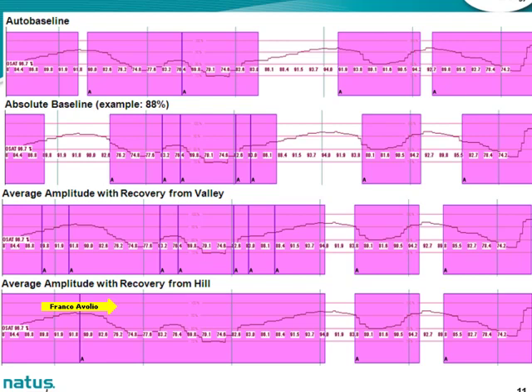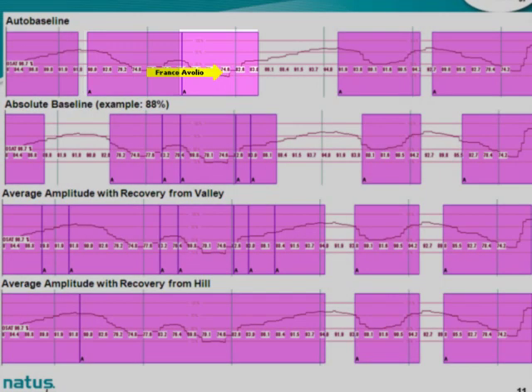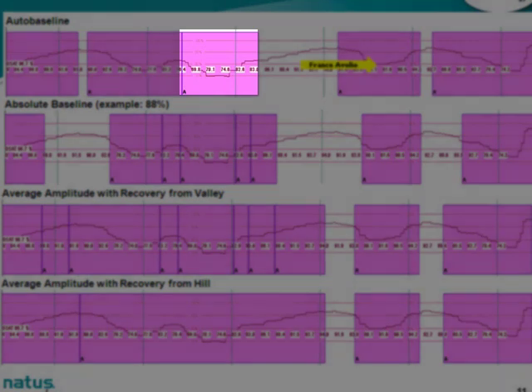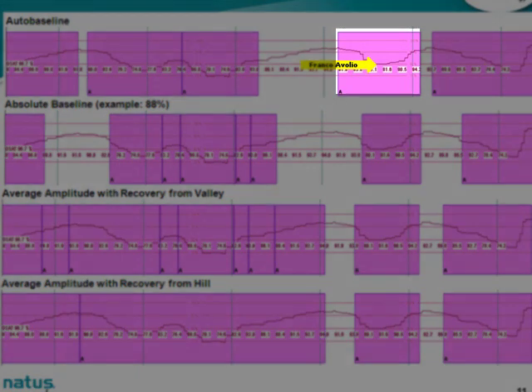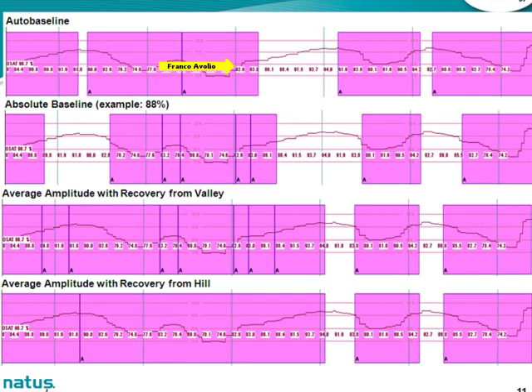I don't think it's the default that is set with the software. It may or may not. I'm not 100% sure. But the auto baseline, if you look at it, the comments I've received from people is that this one clearly shows a drop, it recovers. We call this one event. You see another drop, it recovers, it's one event. You see another drop, it becomes one event. And so this one here, we've got 1, 2, 3, 4, 5 events.